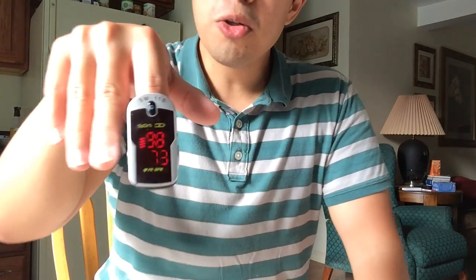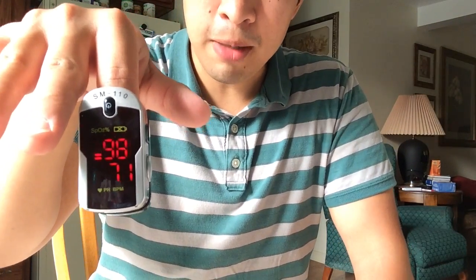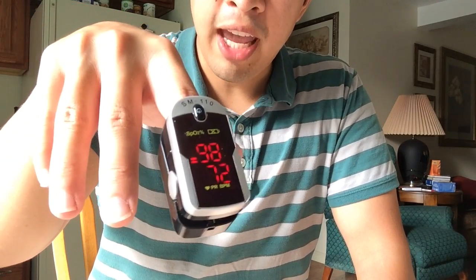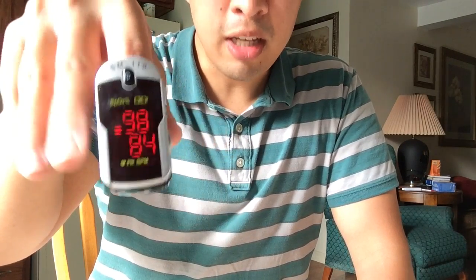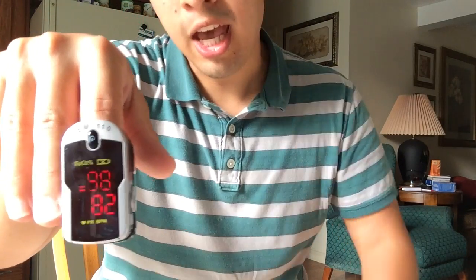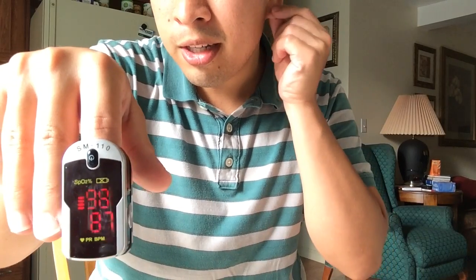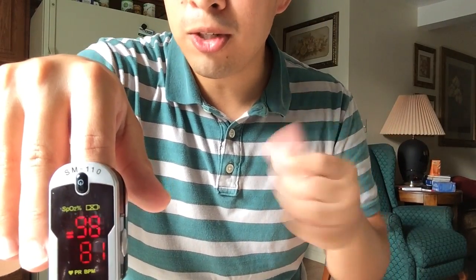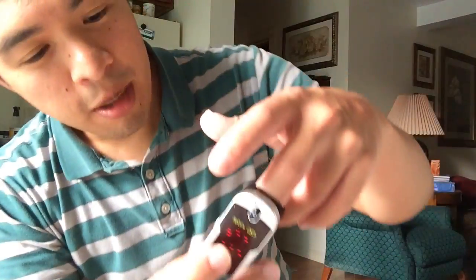I have no circulation issues so it picked up my information quite quickly. If there are circulation issues in the hands, it can take longer and be inaccurate — that's one reason they have ear units, which clip onto the ear and tend to be a little more accurate as to oxygen saturation towards the brain.